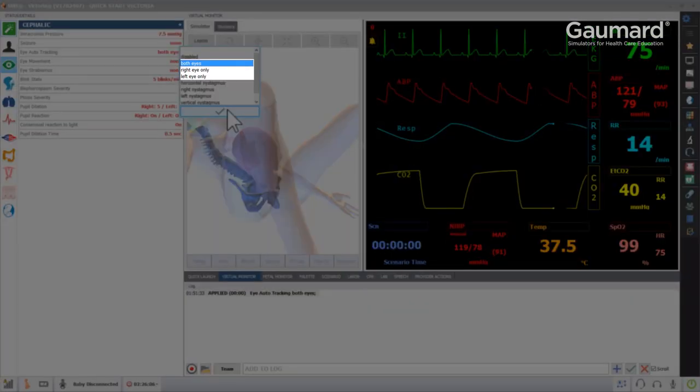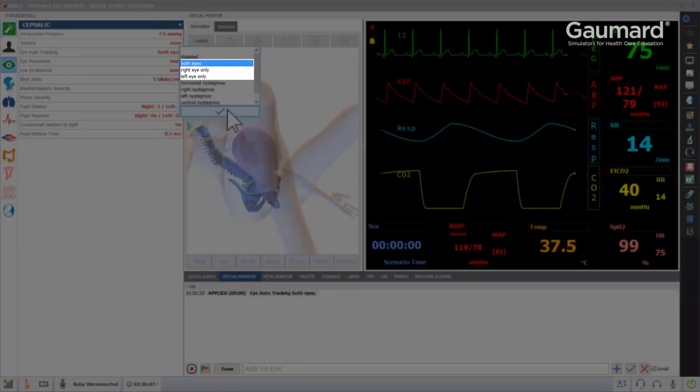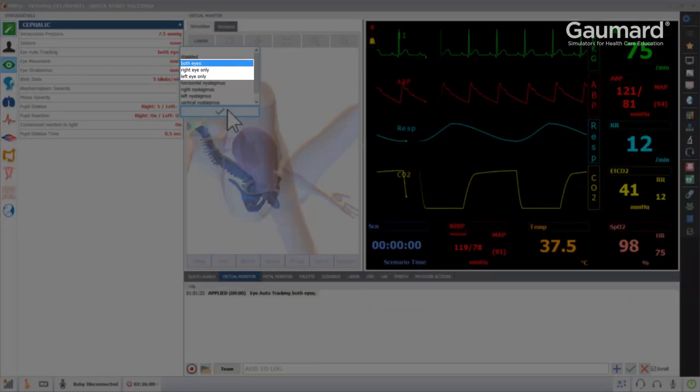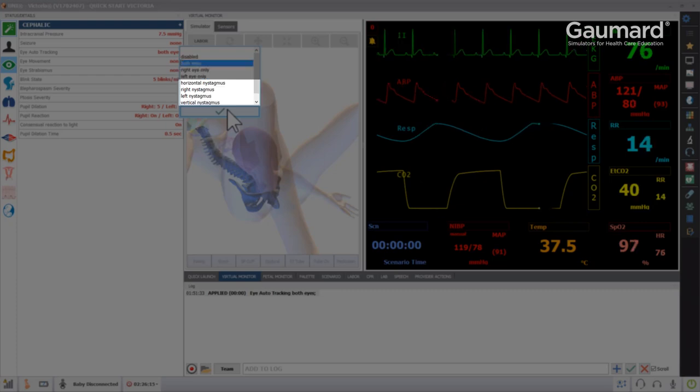In the Eye Auto Tracking drop-down list, you can also enable individual eyes to track objects, or apply nystagmus when the eyes look in a specific direction by choosing these items from the list.